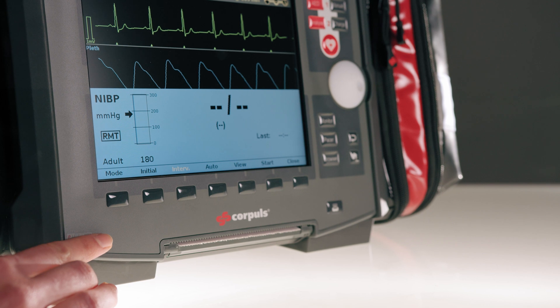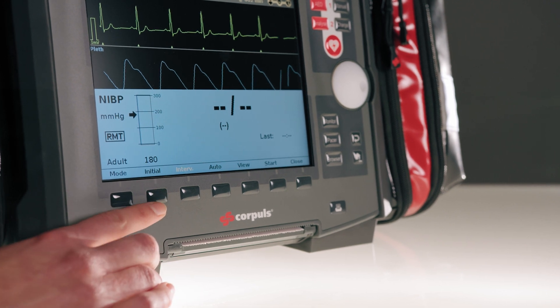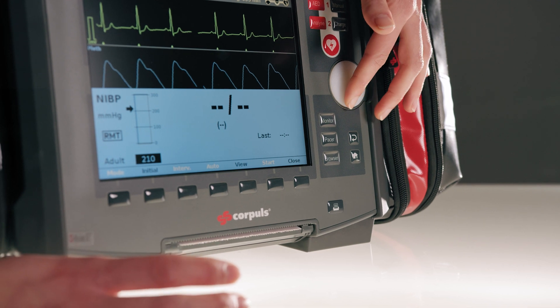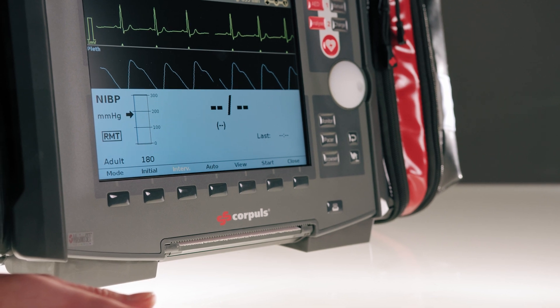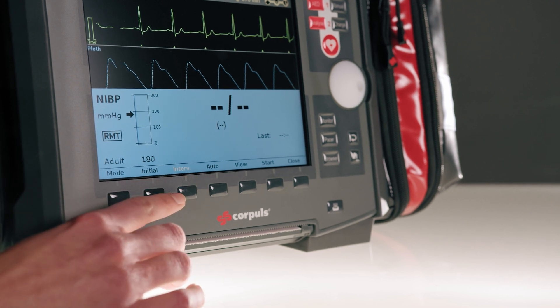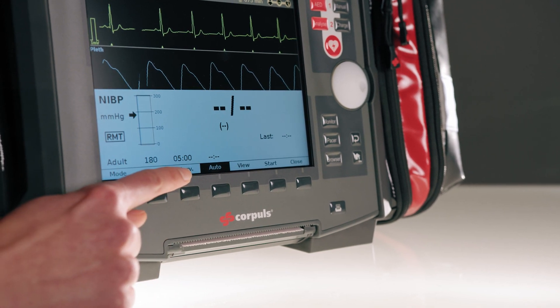And now I would suggest that we take a measurement. To measure the blood pressure, we first open the NIBP menu by selecting the corresponding field. Here I have the option to set the initial inflation pressure. I can use the mode button to select the patient's age group — automatic initial inflation pressures are stored for this. Or I can also set the initial inflation pressure myself by turning the wheel and confirming it with a push. This especially makes sense if I find that there is a strong deviation from the manual measurement to the initial inflation pressure already set. I can specify that the initial inflation pressure should be 20 to 30 mmHg above the measured pressure. I can also activate an interval by pressing auto and then changing the interval time in the interval field next to it.